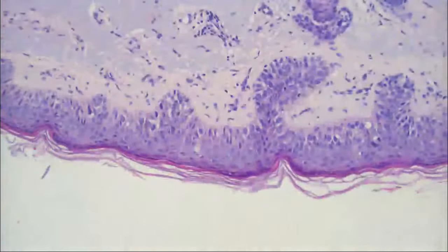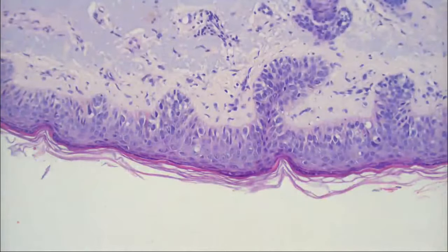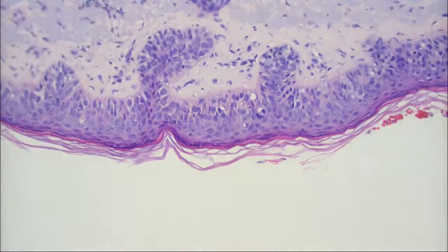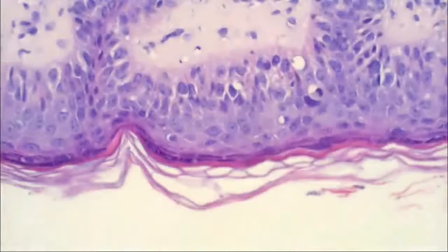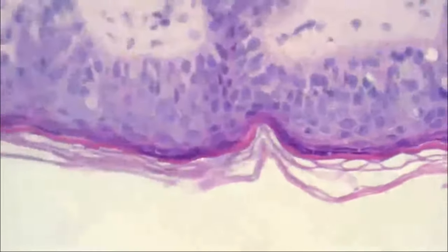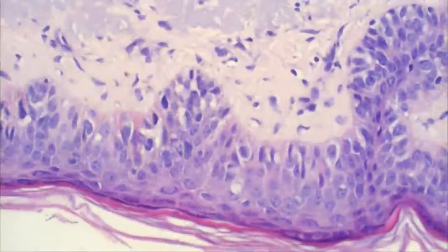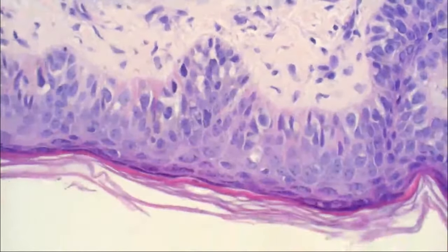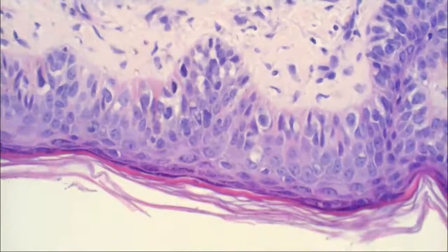It's like a nevus, and melanocytic lesions can, yeah. Melanoma in situ can look like that. There's about 5 or 6 things that can give you a pagetoid intraepidermal proliferative morphology that you need to know. And then would a Spitz nevus also do that? It can give you intraepidermal involvement, possibly, yeah. Like a junctional Spitz nevus. But there's a couple other things too that can give you this pattern.